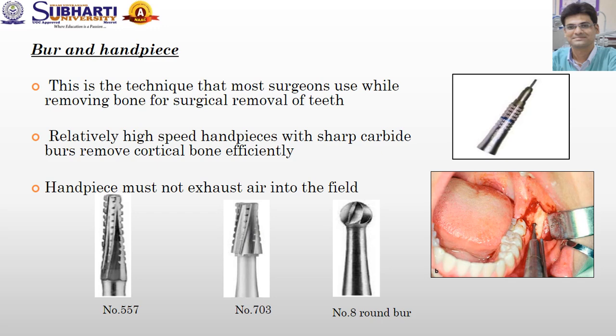In order to avoid surgical emphysema, we should never use the high-speed air turbine handpiece, which is normally used in cases of endodontics.